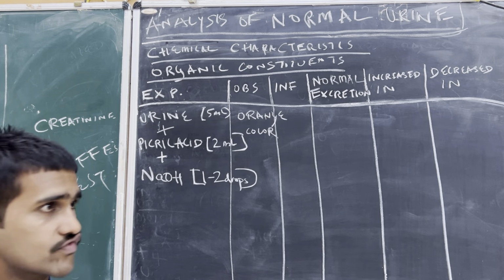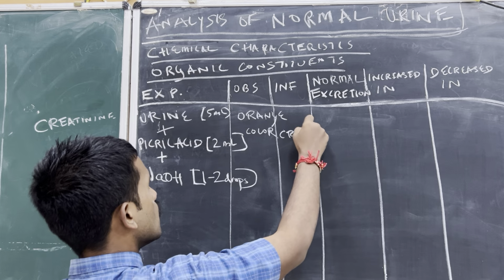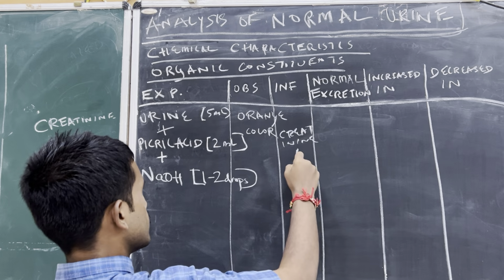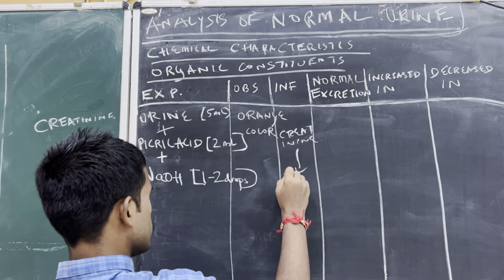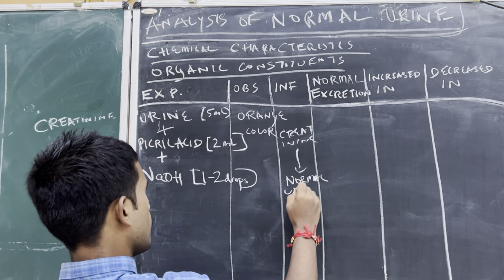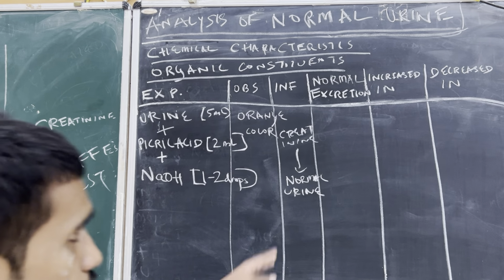Inference: creatinine is present in normal urine.